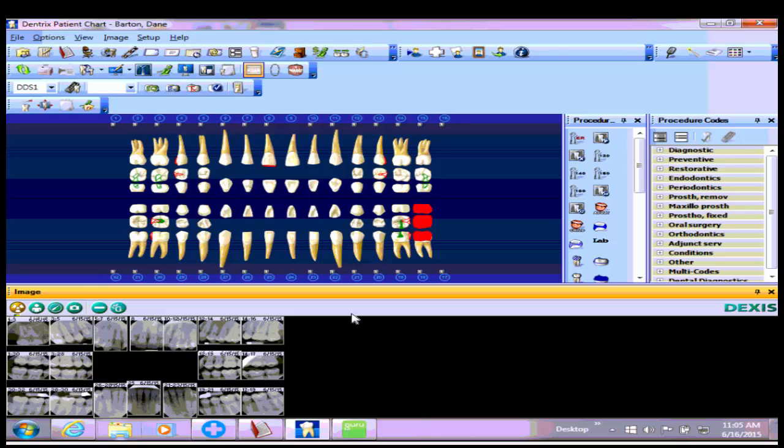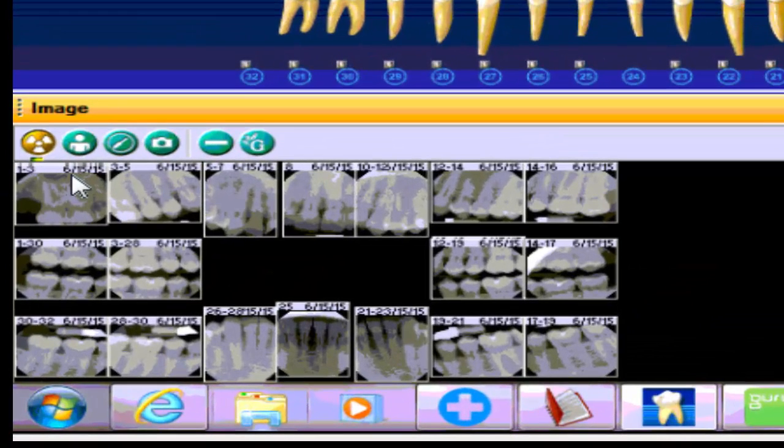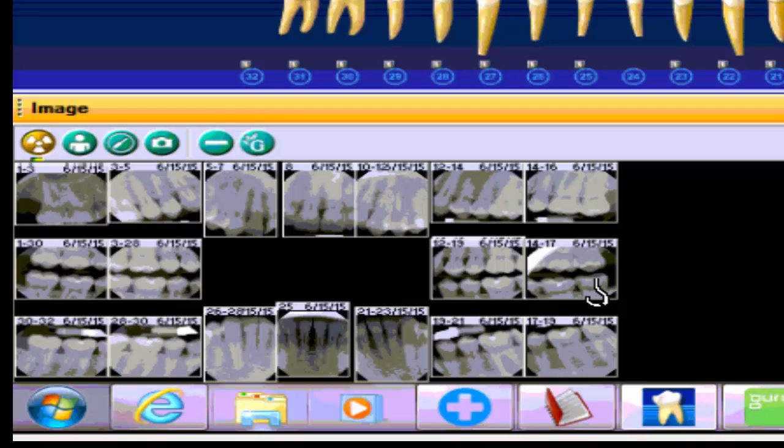You can see that I have a patient chart opened in Dentrix with the integration between Dentrix and Dexis, where I can see the x-ray images down here at the bottom of the screen.